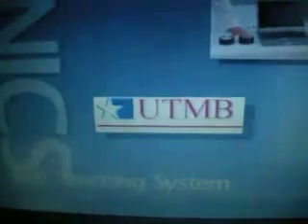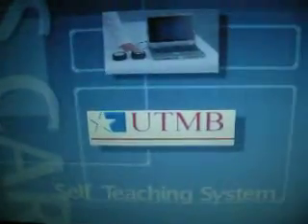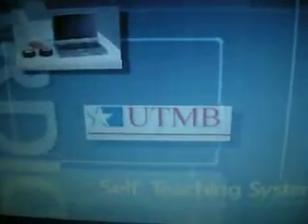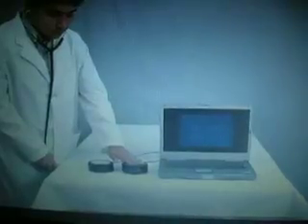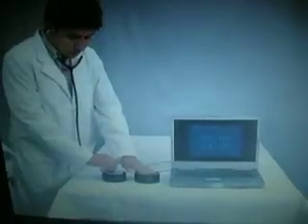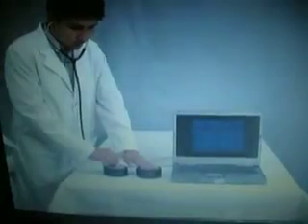Through an agreement with the University of Texas Medical Branch in Galveston, Cardionics can now supply the UTMB student self-teaching system, which consists of 4 computer lessons, an auscultation evaluating program, and a sound reproducer for the student's stethoscope and a pulse reproducer. Developed by William Thornton, MD, a teaching cardiologist at UTMB and former NASA astronaut, the STS system saves instructor time and allows the students to become proficient using their own stethoscope with a sound producer and palpating the pulse reproducer to determine the onset of systole.